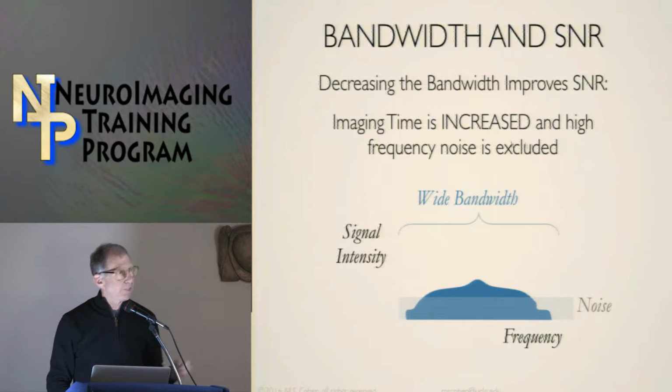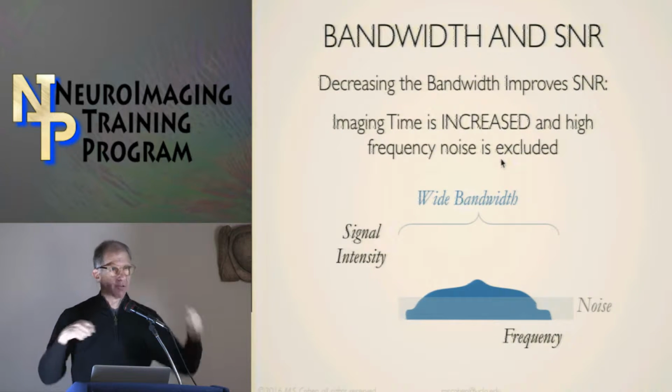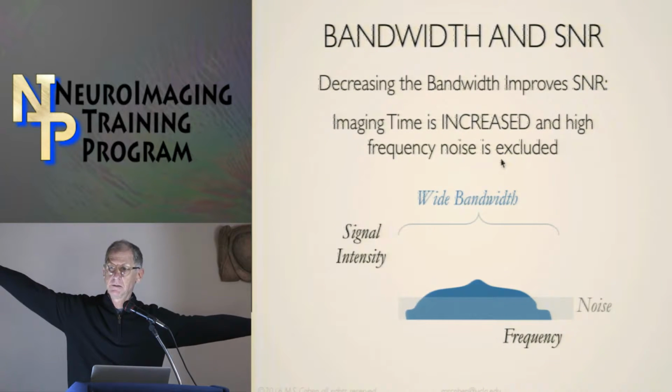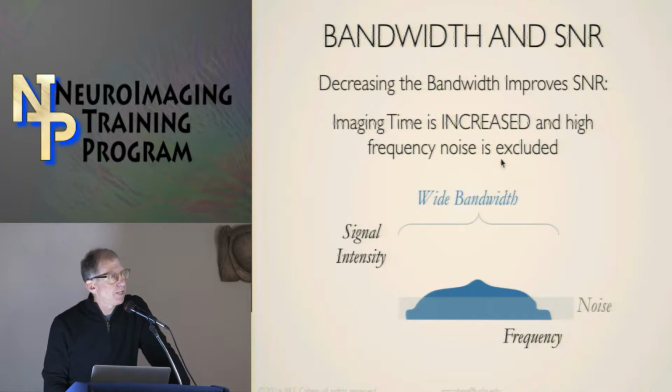Now, the wider you separate them by frequency, of course, the less energy there is at each frequency. Does that make a certain amount of sense? Right? You're just spreading the signal out. Okay? However, noise in the MR scanner tends to be broadband at all frequencies, essentially equally.